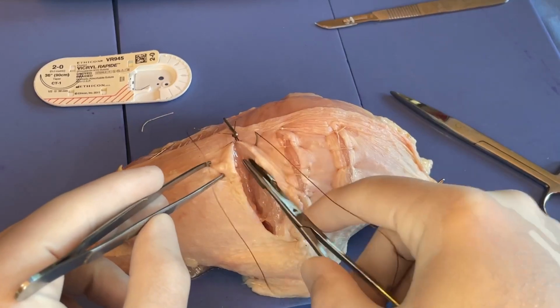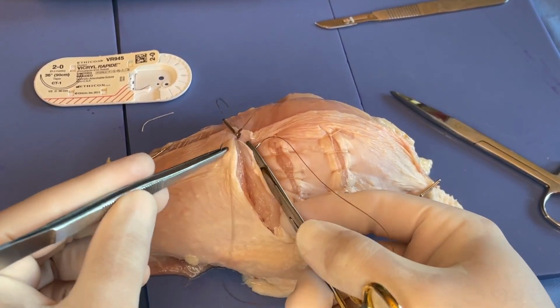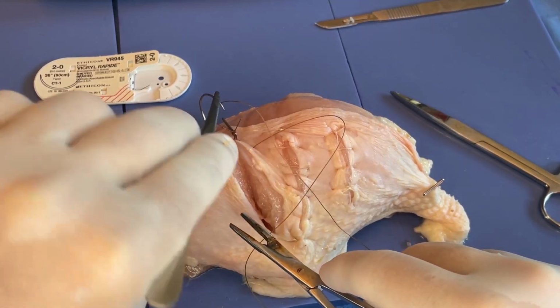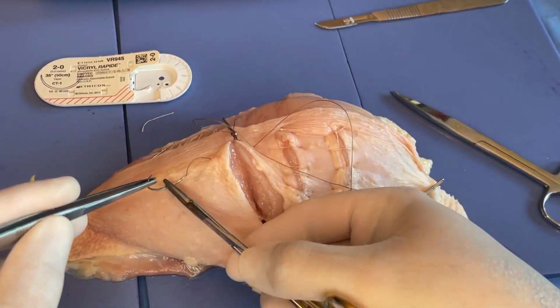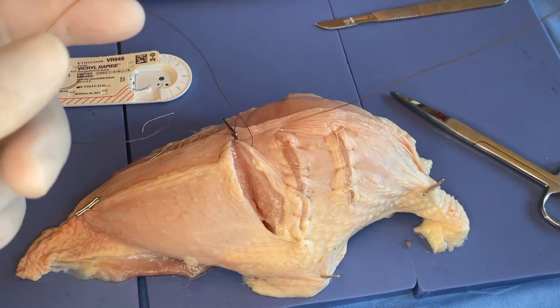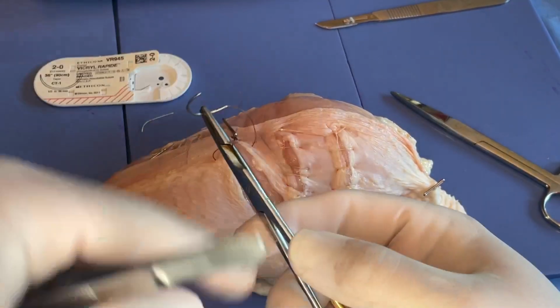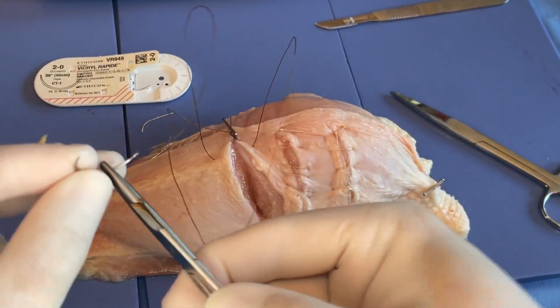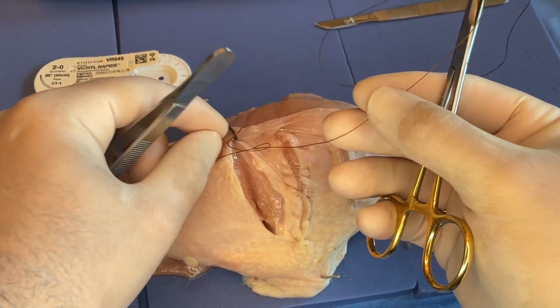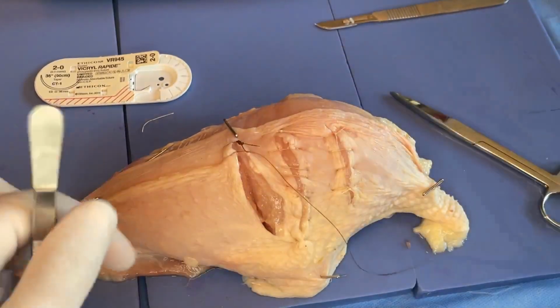I can't quite see my needle tip, so I'm letting go of the needle and backing up on it, and then continuing to drive it through until I see the tip, grab it with the forceps. If it'll just slide right out as I curve my hand over, that's fine, and then I can reload here down at the tissue. But what my assistant's going to do, instead of just pulling it through like this, that's what we did with our running continuous there, we're going to take the needle and pass it through the loop. So what that does now as we tighten it is, you can see here that we're pulling through this loop, and we get some extra tension created along that area we're closing.